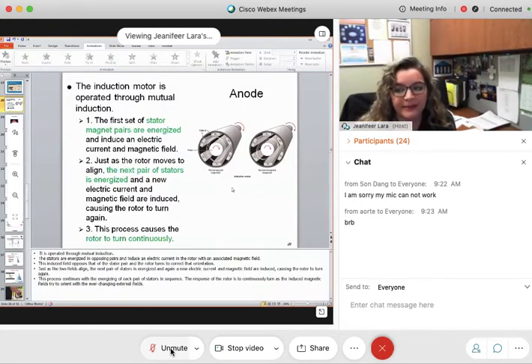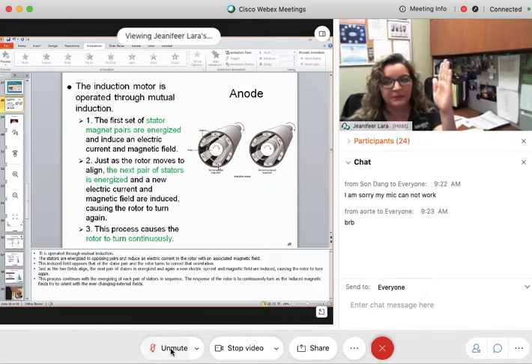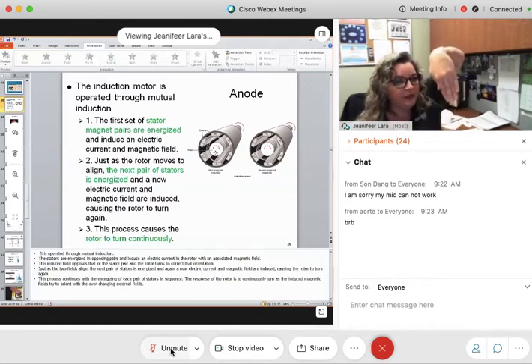what we're basically saying is here we have the iron, and the iron is going to move in a direction, aligning its north and south pole, because if you have a piece of iron, it is going to have a north and a south pole. If this magnet and this magnet are magnetized the same way, the iron is going to flip to match it.